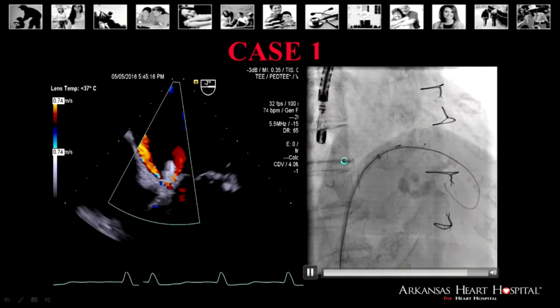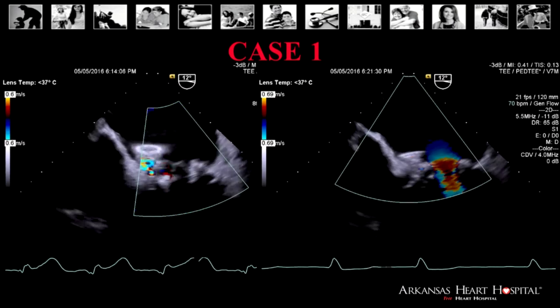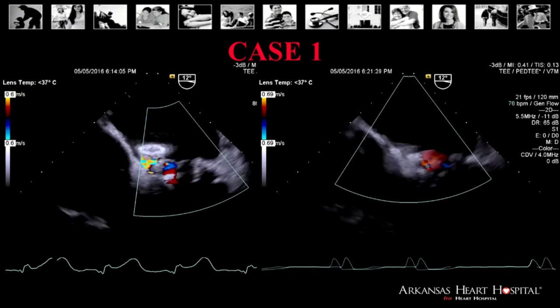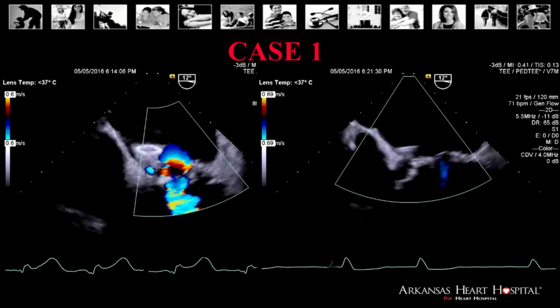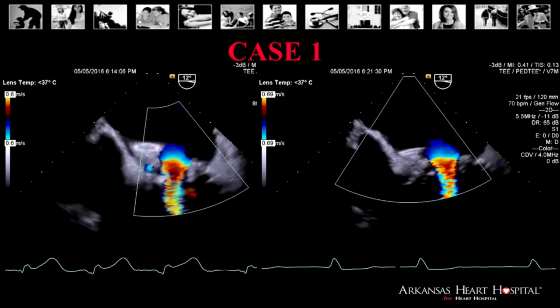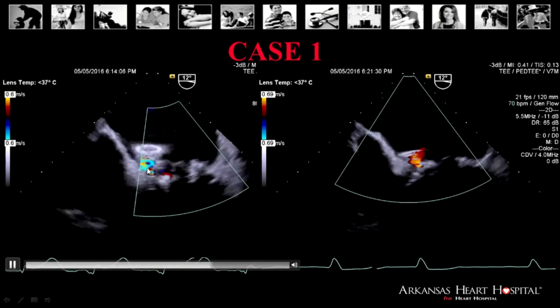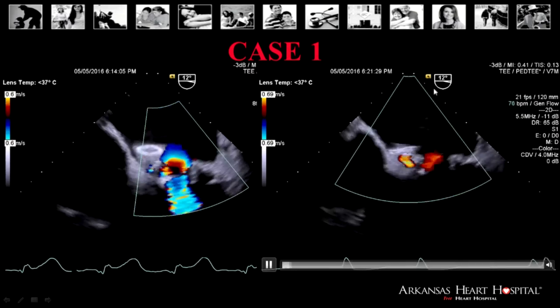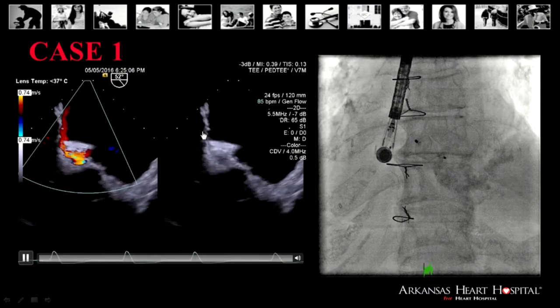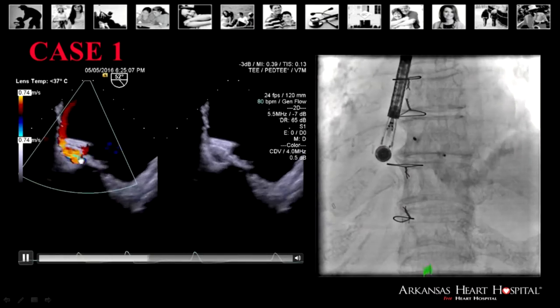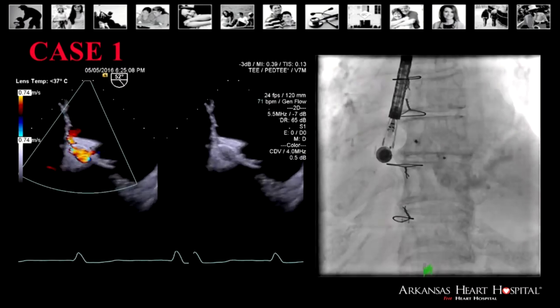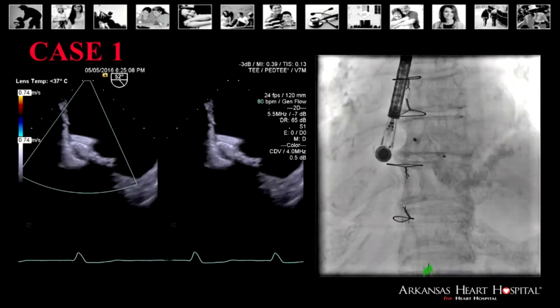We exchanged for a wire and eventually put in our first device. Dr. Mago and I joke now that we've created an algorithm — whatever size we think it is, we add four millimeters and that fits in most cases. As one of our earlier cases, we started with one device and you could still see a reasonable amount of leak around the mitral ring. So we recrossed and ultimately placed what we call an Amplatzer Vascular Plug 2. This device looks like two donuts, or like a piece of licorice — you have the candy wrapper on the sides and the thick piece of candy in the middle — fitting between the structures to seal that leak. She has much less of a leak comparatively, and as the body creates its own pannus around this prosthetic device, there will be less of a leak over time, which is exactly what happened for this patient.